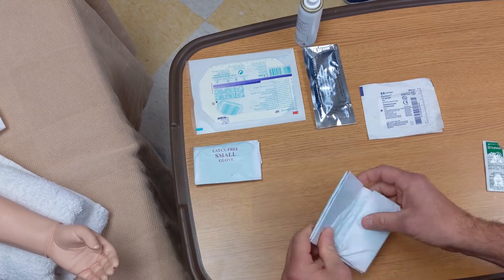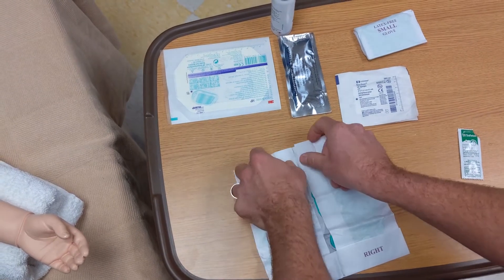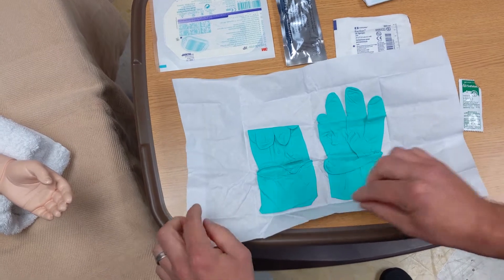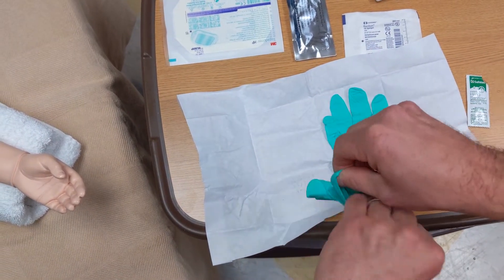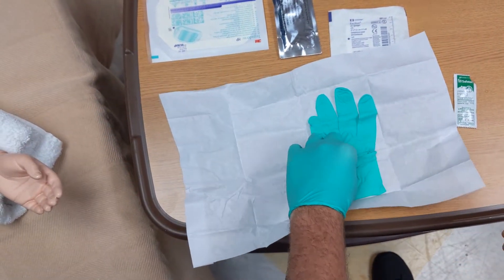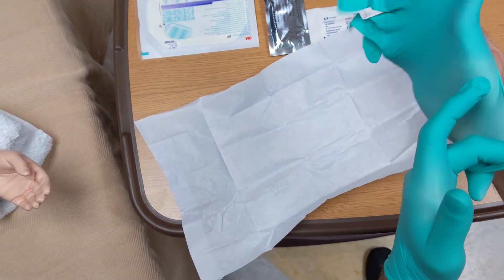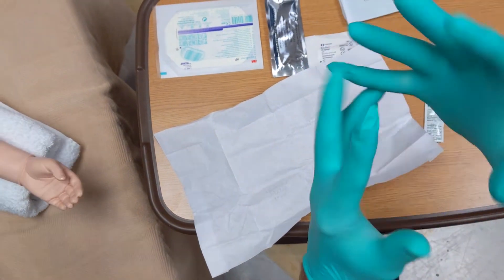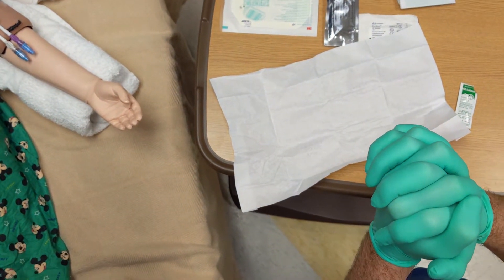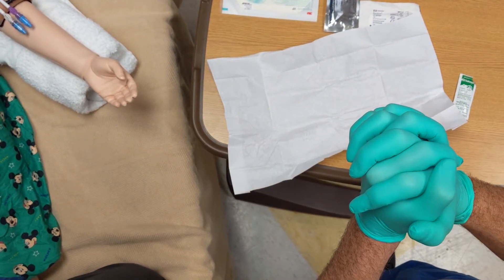Don your sterile gloves. You want to open the sterile gloves without touching the inside. Pick up the glove — you can touch the cuff part that's folded over to help you put it on, but don't touch the part that's going to be exposed to the outside. Pick up your other glove and put it on the same way. You are now sterile. You don't want to touch anything that's not sterile or you will break the sterile field and need to start over. One of the most important things we can do is keep yourself sterile while doing a dressing change to prevent infection to the central line.